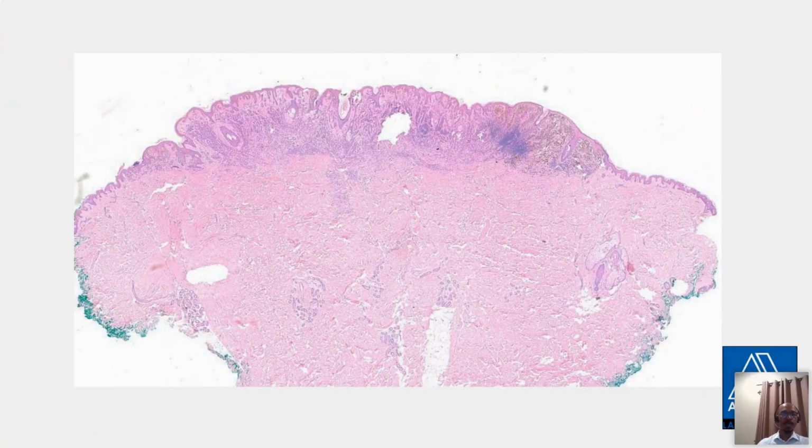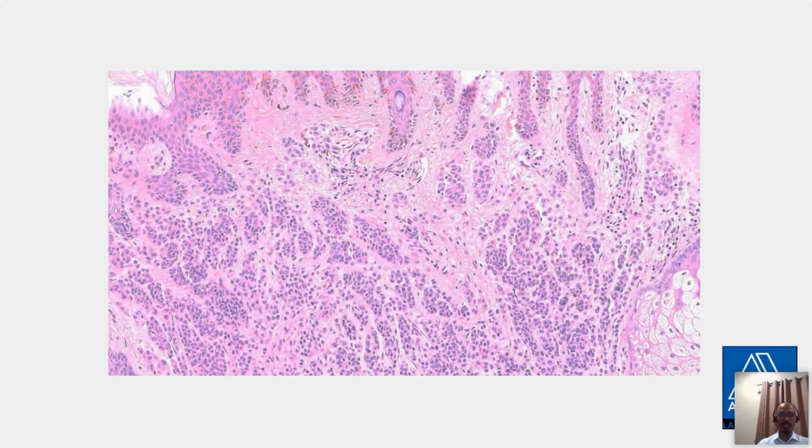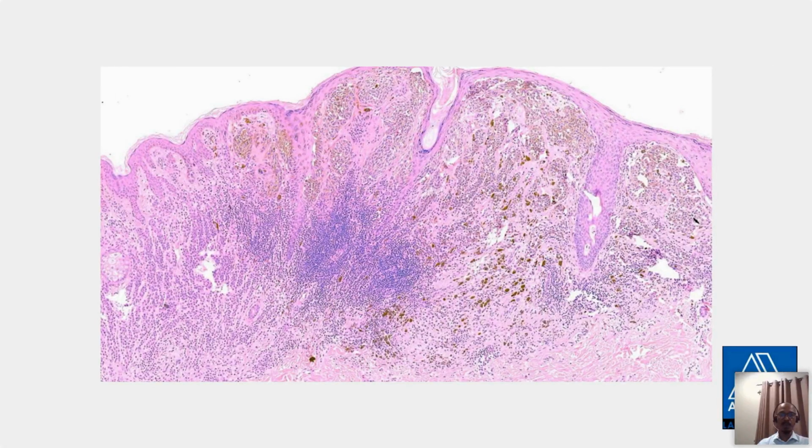But sometimes what you get is this, a lesion that's quite nicely circumscribed, looks quite innocent at low power. However, you'll appreciate that it's not quite symmetrical because there's a lymphoid infiltrate on the one side of it, or rather a lot of pigment on this side, whereas the other side kind of looks okayish. And on this side, you can appreciate nice maturation. You've got superficial nests with cellular dispersion with depth of the lesion. The melanocytes are bland.